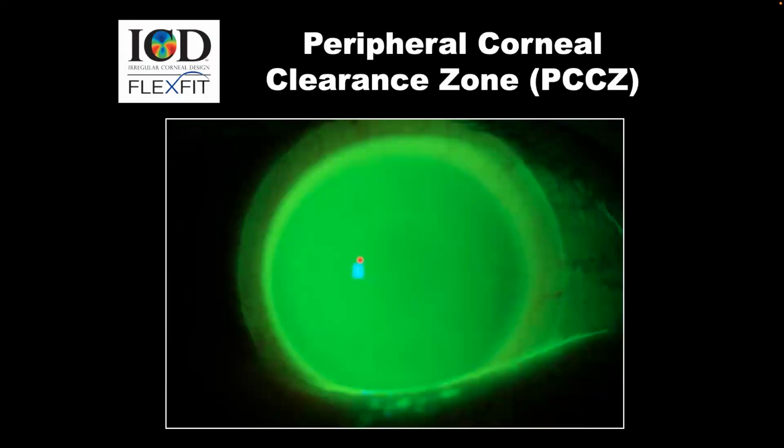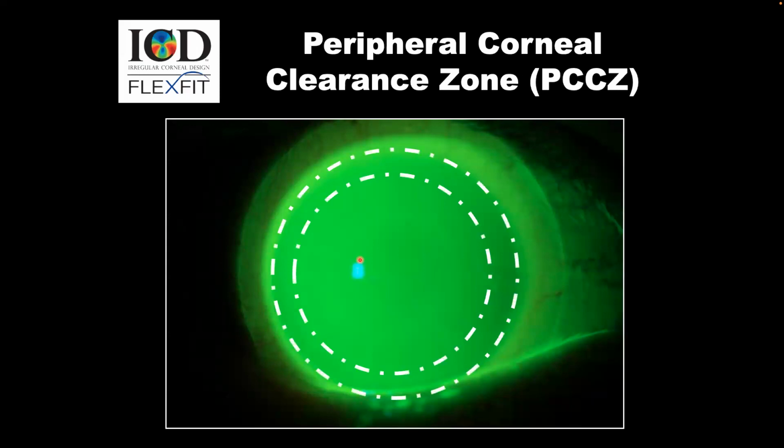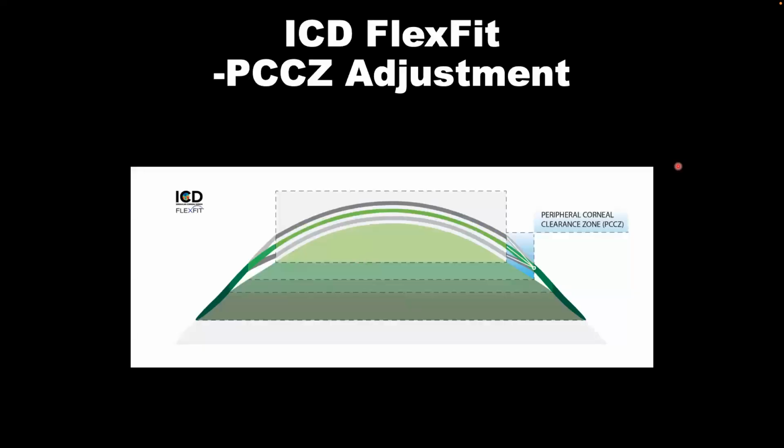So like I was telling you, the peripheral curve is in this area here. And this, like I was telling you, will affect the central sag. So changing this, you will change this in 25 micron steps. What is suggested is just not going over 200 microns. I mean, if you go over 200 microns, you might as well just change the lens and go to a different sag.